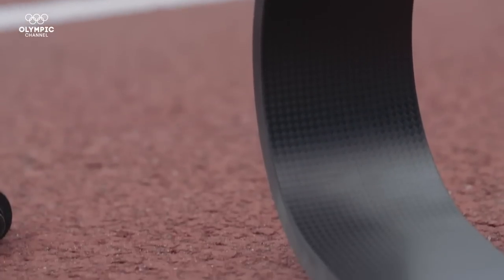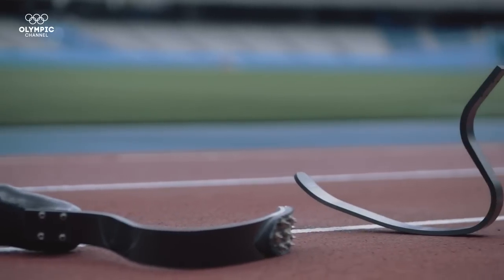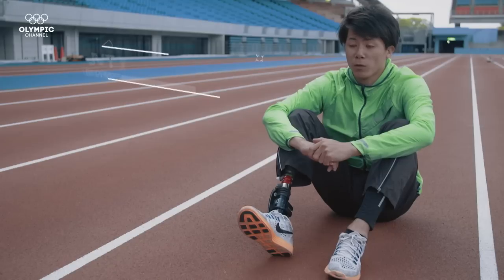The blades are trans-tibial prostheses, meaning they replace legs and feet that are amputated below the knee, and are designed by specialized engineers.